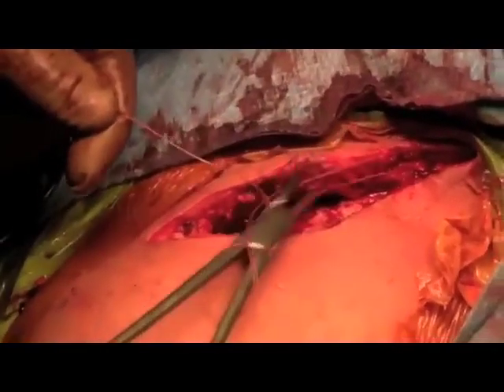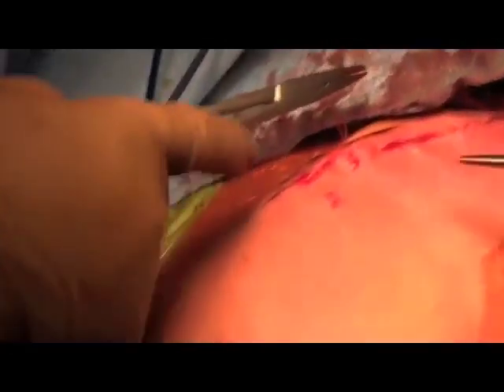The deep fascia is repaired with interrupted Vicryl sutures. The skin is repaired in 2 layers with a subcuticular repair.